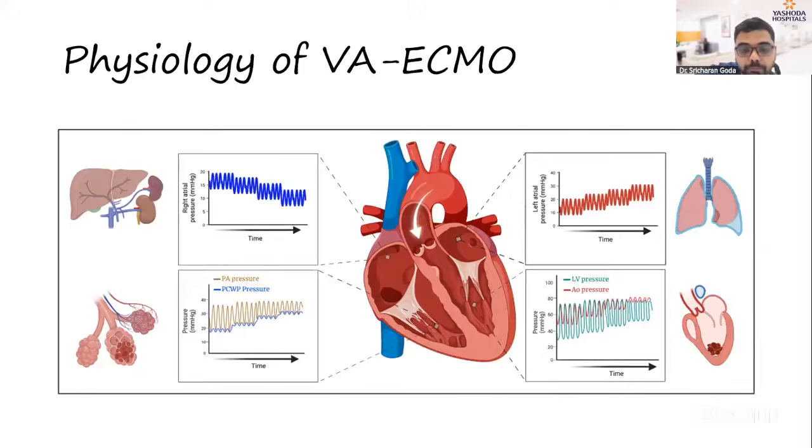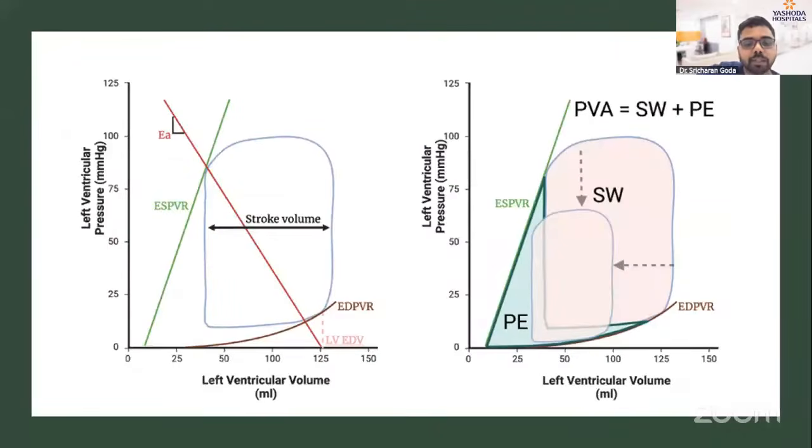Before we go into the concept of LV unloading, we need to understand that the concepts of LV unloading are better understood if we correlate them with pressure volume loops.